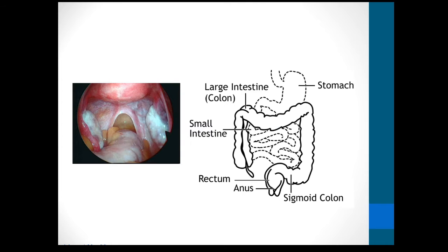Looking at the bowel is also an important part of looking for deep infiltrating endometriosis, because if there is a lesion on the bowel, it is very crucial for the surgeons to know this in advance, as they may require the help or the presence of a colorectal surgeon at the surgery.